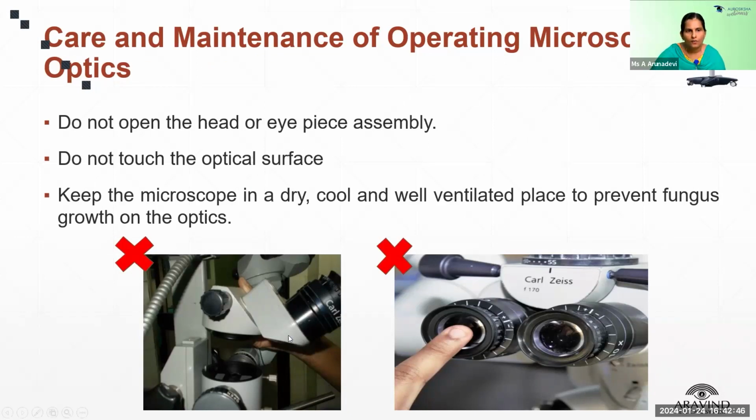Care and maintenance of optics. Never dismantle or disturb the binocular assembly. Do not touch the optical surface with a bare finger. Keep the microscope in a dry, cool and well ventilated place to avoid fungus growth on the optics.